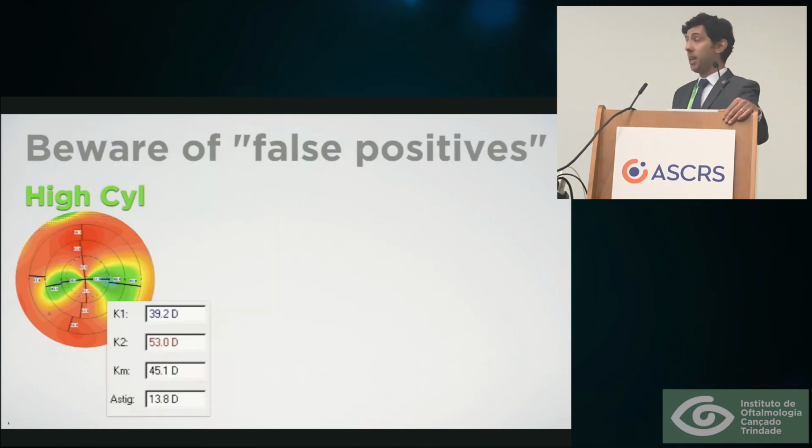And sometimes it's important to be aware of false positives. What I call false positives are those patients who really are excited with a pinhole occlusion test, but at the end we don't find a very good result with the implantation of a pinhole implant. And there are certain conditions here that I've had a difficult time to see. I might think that this is a good candidate and the result was suboptimal.